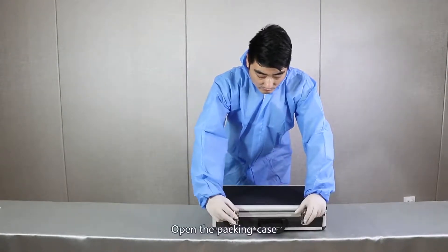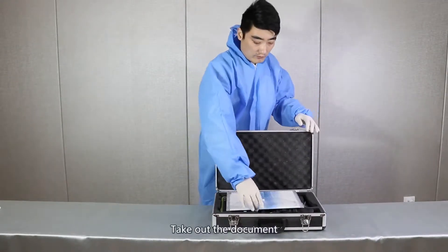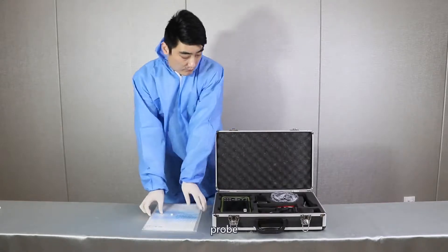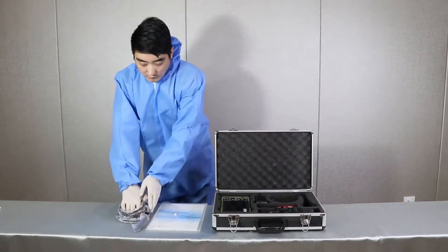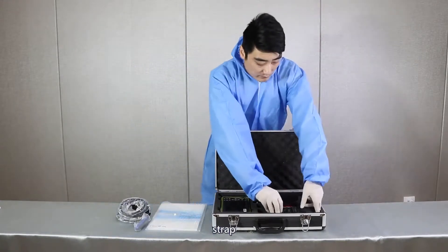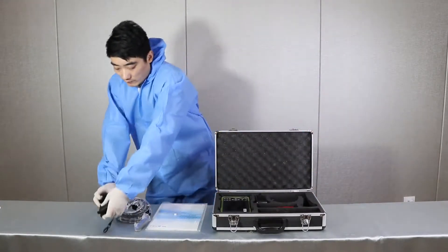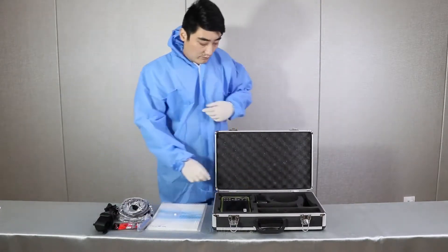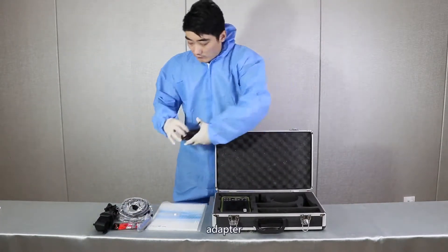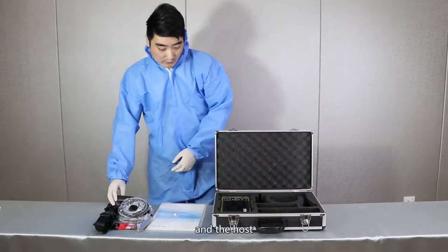Assemble demo. Open the packing case, check out the document, probe, strap, card reader, adapter, and the host.